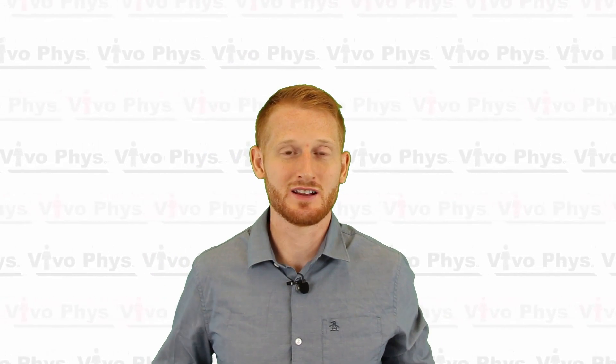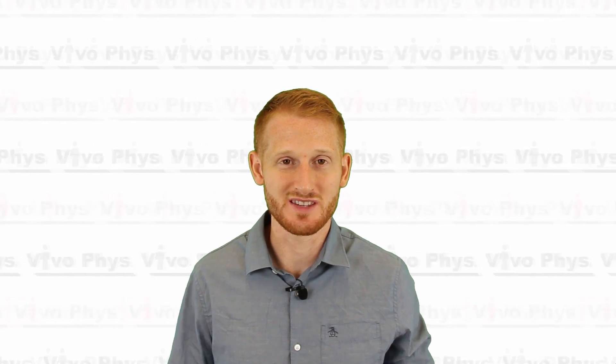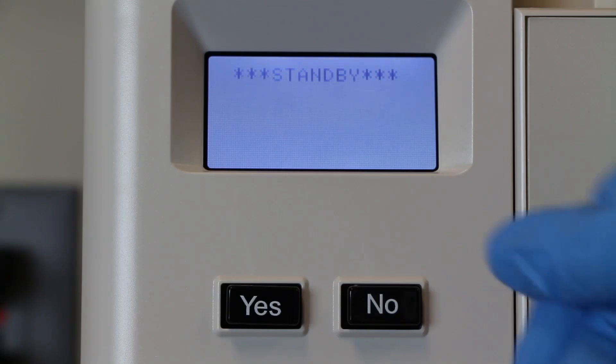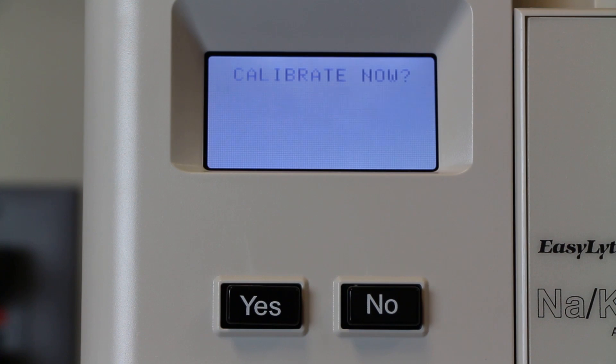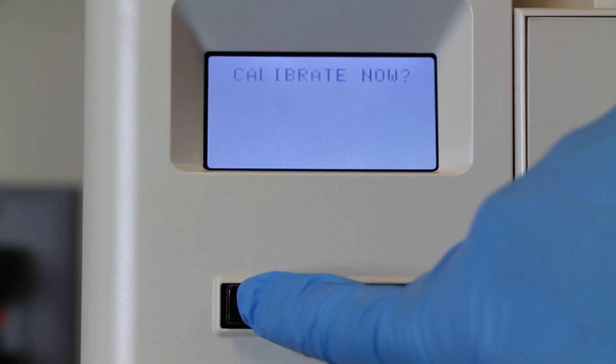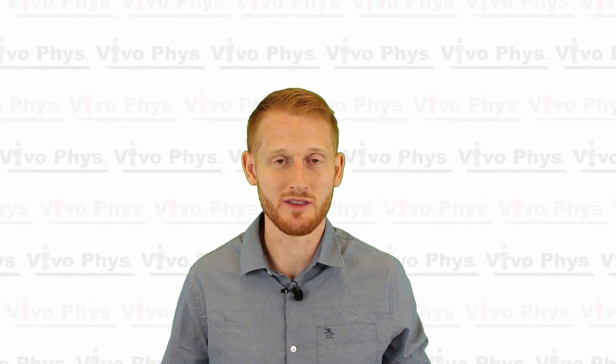This electrolyte analyzer is essentially on all the time — anytime it's plugged in, it's turned on. However, when it's not being used it goes into a standby mode. To get it out of standby mode you have to run calibration. Simply hit the yes or no buttons on the screen until you see the option to calibrate, then hit yes. This is going to take a minute or two, running a couple of different calibration standards within the electrolyte module inside the machine.